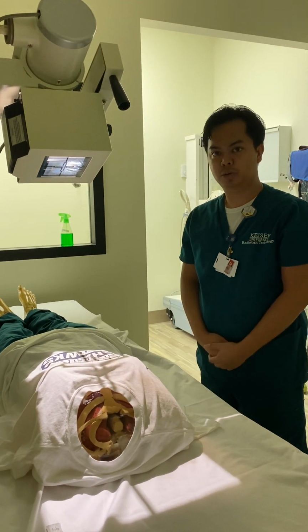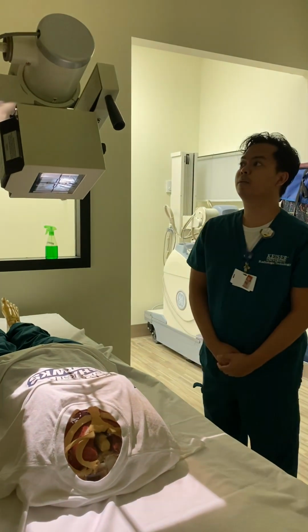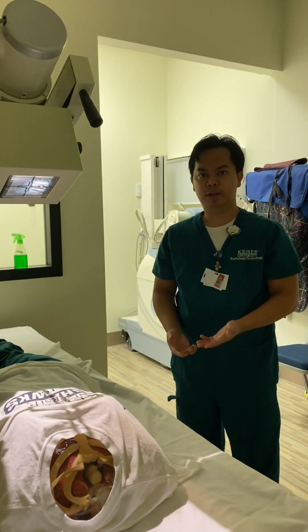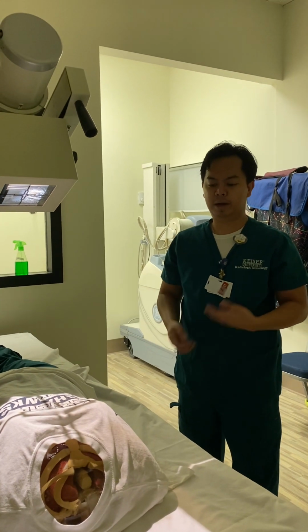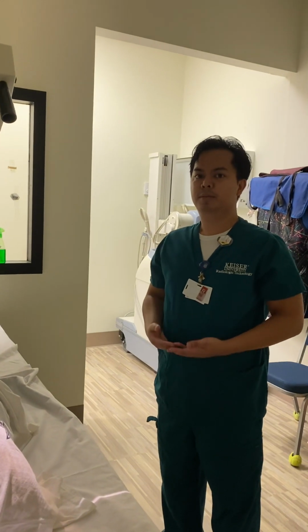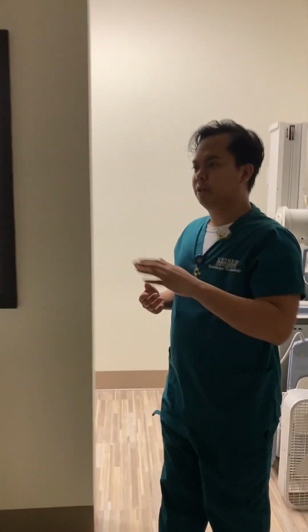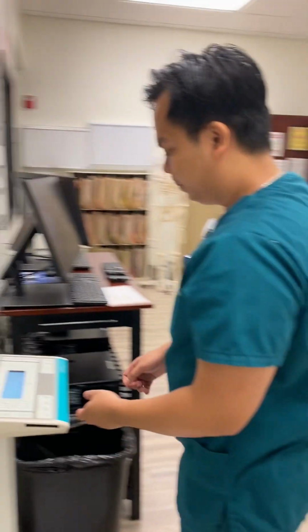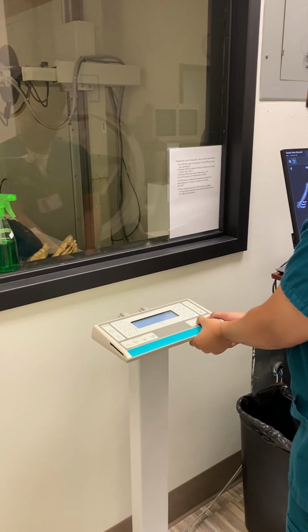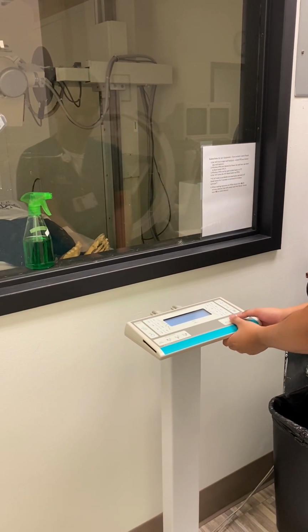So now you're ready to take an image. Make sure this is aligned, everything looks good. And we're ready to do the breathing exercise. So you'll have the patient do the breathing exercise. It'll be their second inhale. One way for me to help them is to do the breathing exercise with them. So I'll tell them to inhale, exhale, and I'll tell them to inhale again. And tell them to hold their breath. Then once you're ready, tell them to hold their breath and press the prep until it's green solid. Once it's green solid, press expose and you're good.